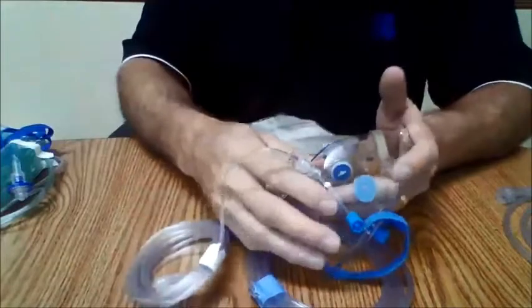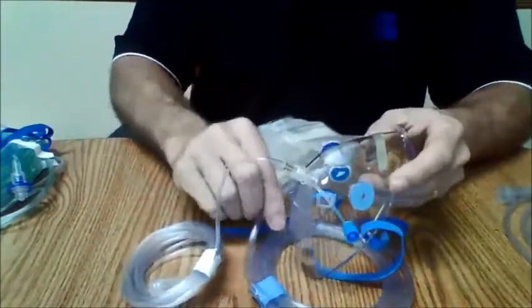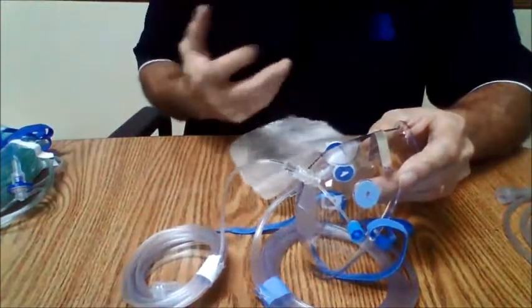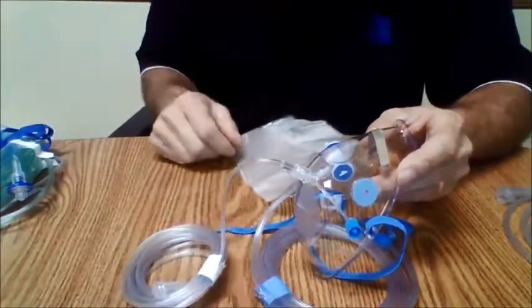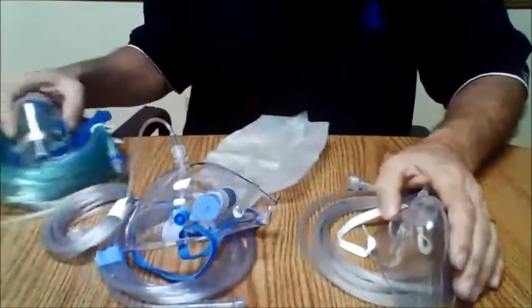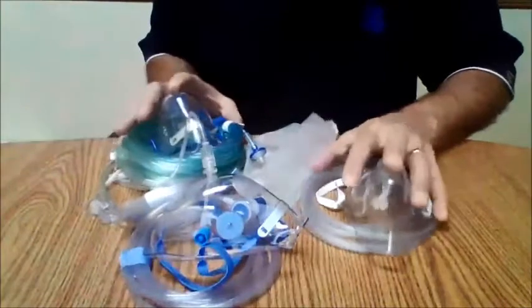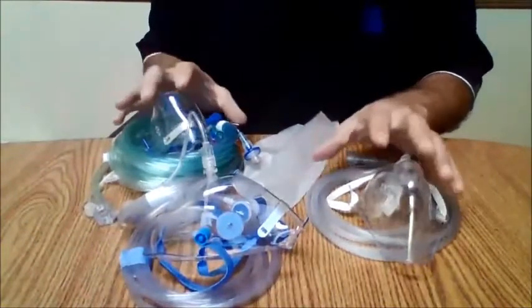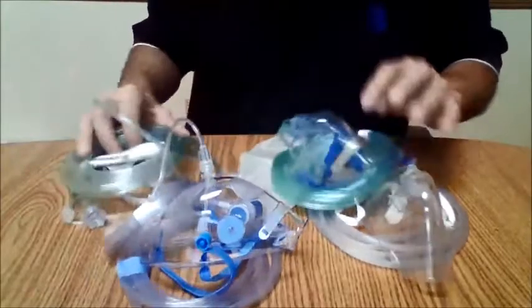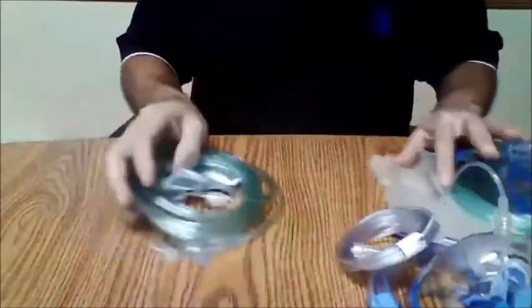As the patient inhales, they're getting oxygen from the supply tubing and also from the reservoir bag, and that increases their inspired oxygen percent. So once again, you're up in the 90% range with this. You're probably in the 70–80% range with the Capno mask and the Capnoxygen mask, and then you're in the 30% range with your nasal cannulas, or 30 to 40%.